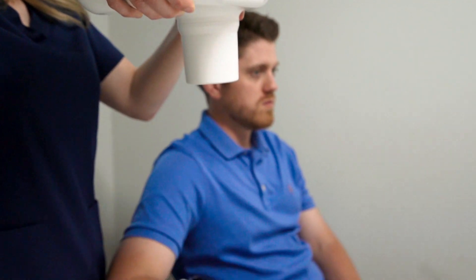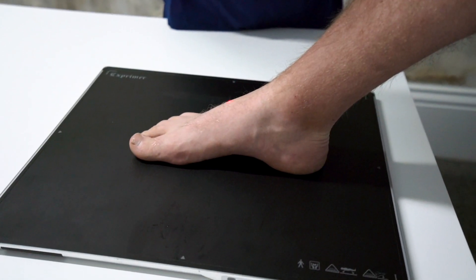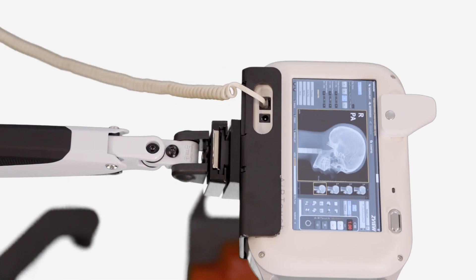I'm Jessica and I'm here to tell you all about Europa, the most portable x-ray device on the market, formerly known as AirTouch. Europa is the most versatile x-ray system serving industries including but not limited to podiatry, orthopedics, and sports medicine.